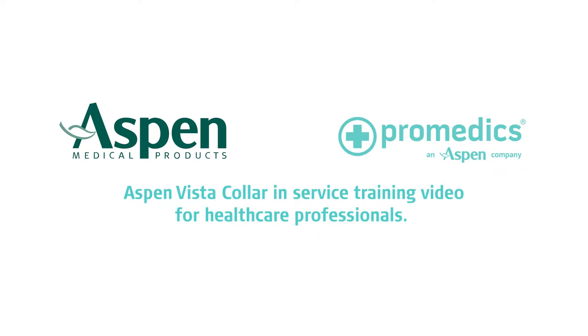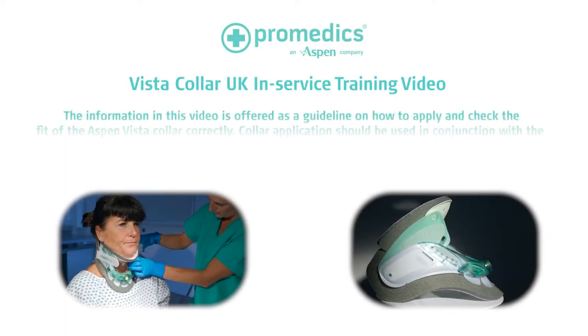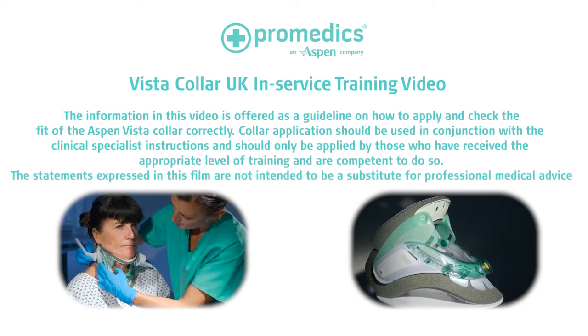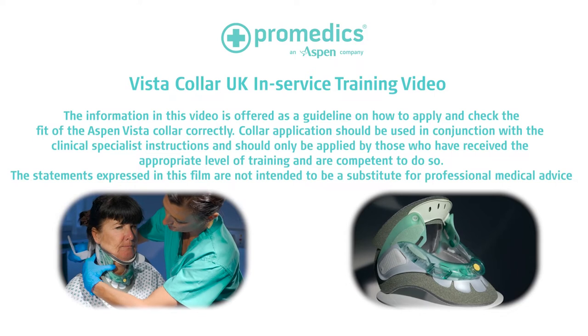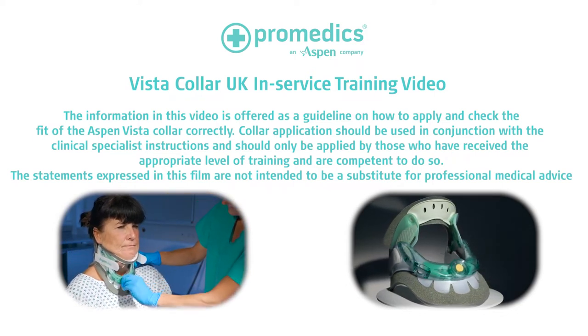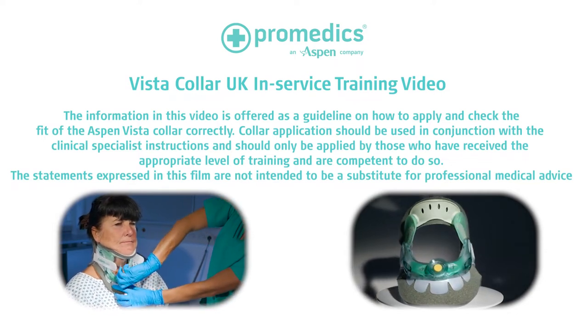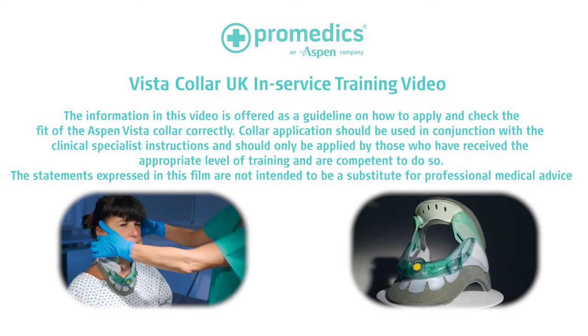This is an Aspen Vista Collar in-service training video for healthcare professionals. The information in this video is offered as a guideline on how to apply and check the fit of the Aspen Vista Collar correctly. Collar applications should be used in conjunction with clinical specialist instructions and should only be applied by those who have received the appropriate level of training and are competent to do so. The statements expressed in this film are not intended to be a substitute for professional medical advice.